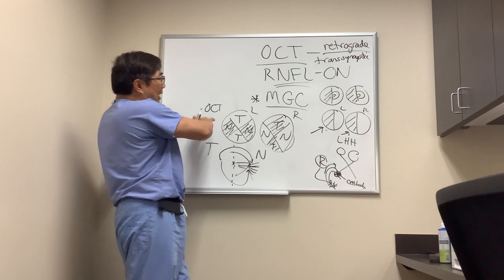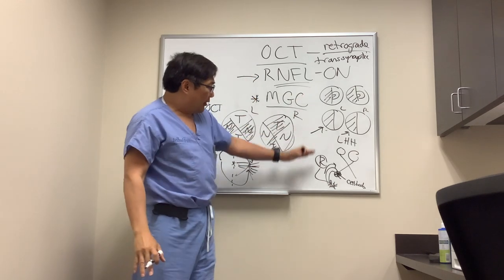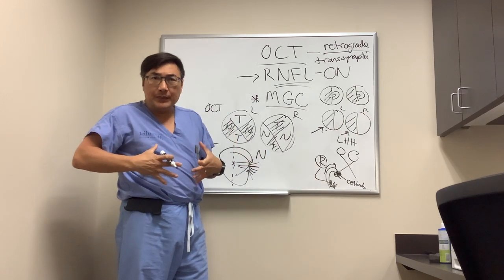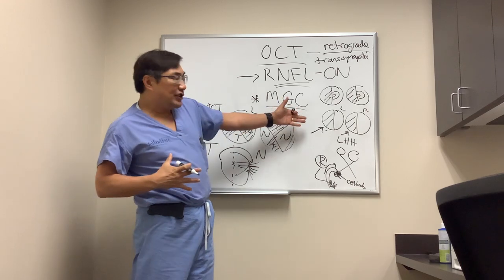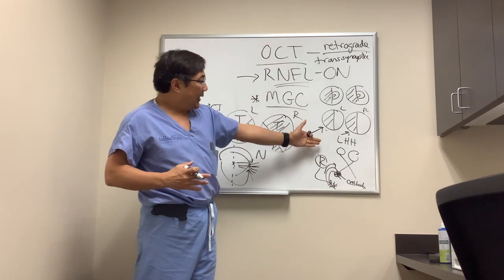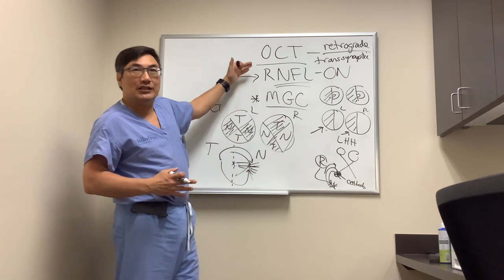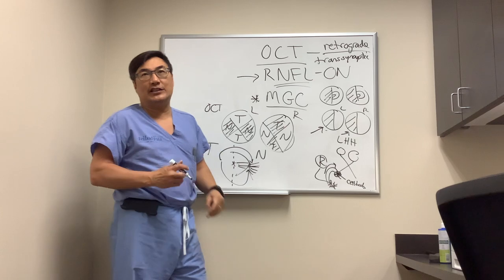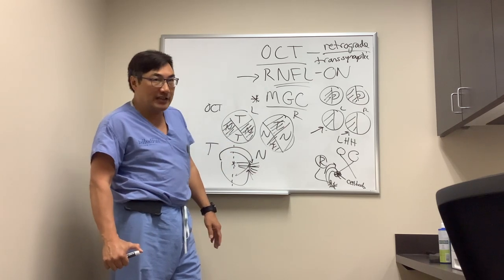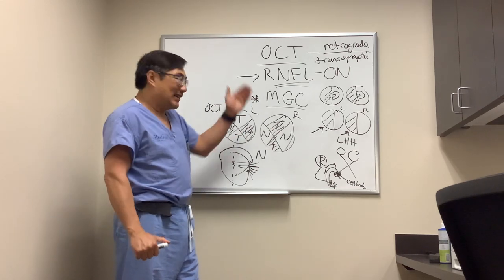So we can see on the RNFL and in the macular ganglion cell layer a marker of occipital lobe lesions, especially if they happen in utero. Congenital lesions can cause trans-synaptic retrograde degeneration — the patient has a homonymous hemianopsia, it jumps the synapse, and shows up as a hemianopic pattern in the ganglion cell layer and band-type atrophy in the eye with temporal field loss, representing nasal fiber loss — in this case the left eye.